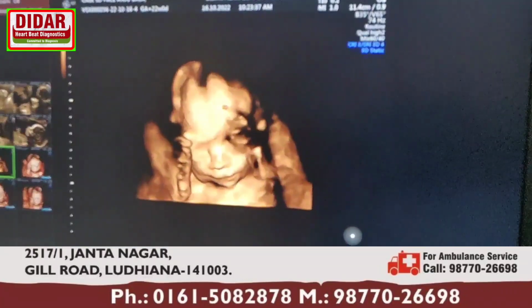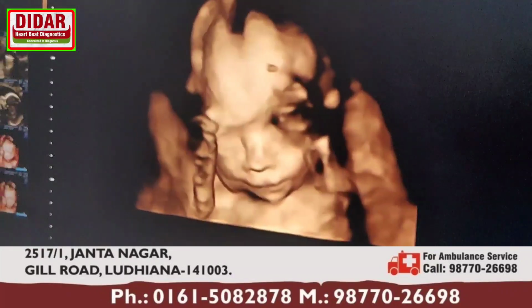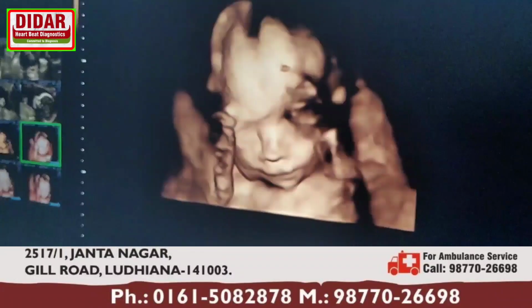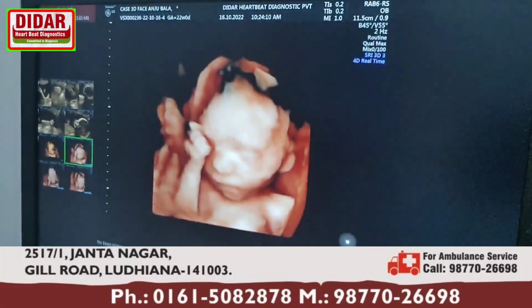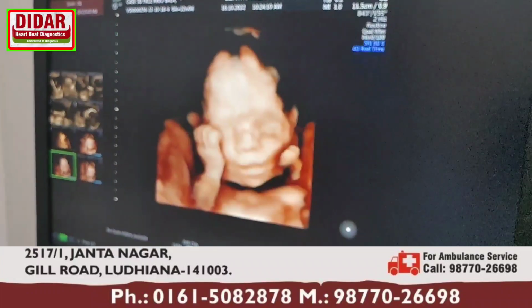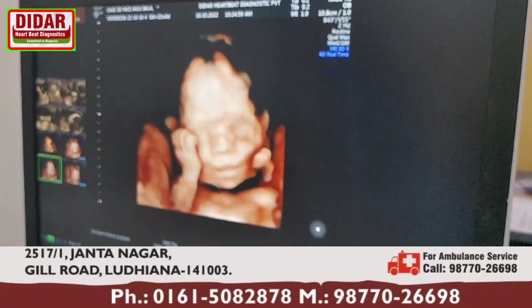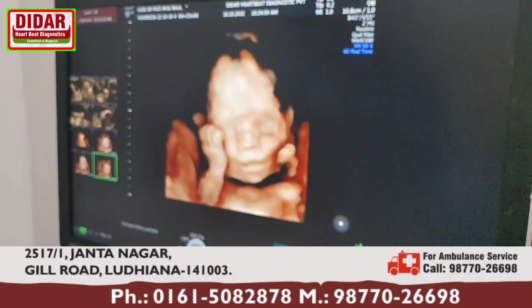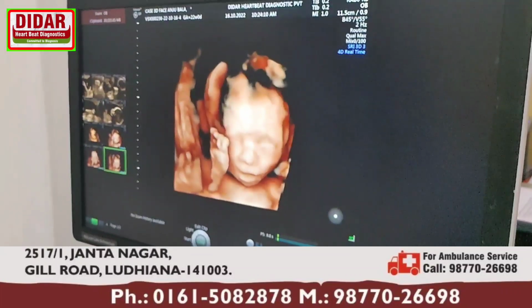So these are 3D images of the fetal face. We can do this for every part also, but the majority we do for the fetal face. And if there is some defect somewhere in the fetus, then we also do 3D 4D reconstruction of those images. Here the baby is thinking something, putting his hand over the face. These kinds of beautiful images we also see in 3D 4D scans.